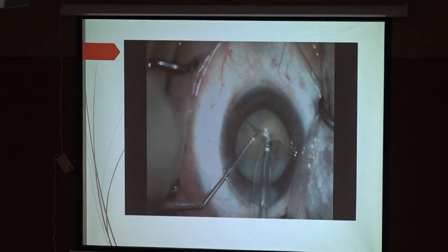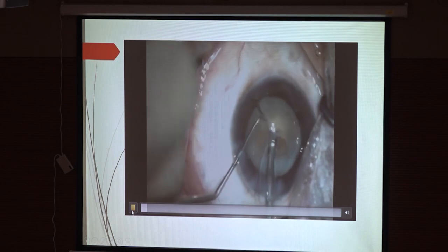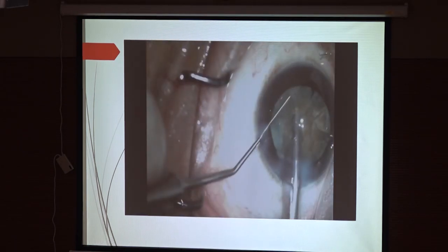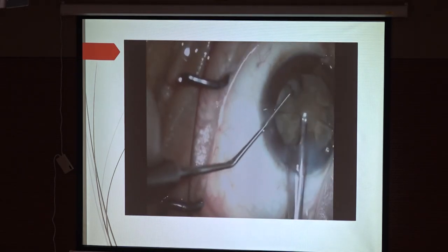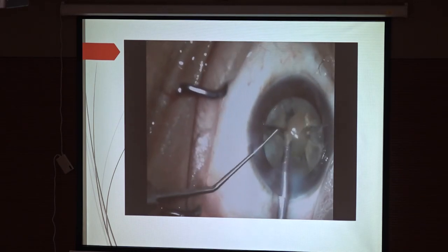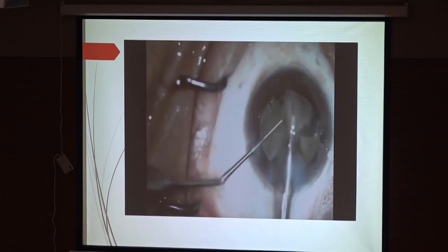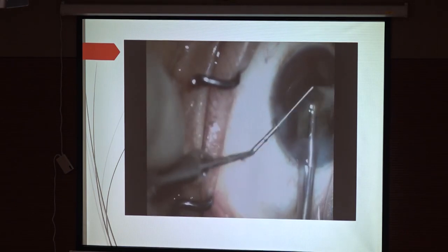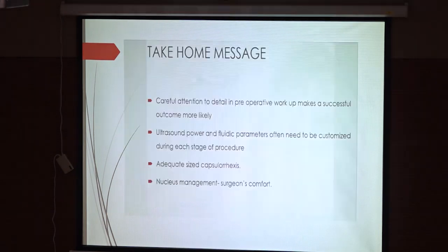So then this is the technique which I call flower petal technique. This is most commonly used. In majority of patients we are doing this. So you go at the center and try to make multiple cracks. These cracks won't go to the posterior plate. Posterior plate is still intact. So it's like a flower petal appearance. So then debulk the center and then tackle individual petals partially. Central core is still intact, and in the end you can bring central core a little anteriorly and complete the phacoemulsification.